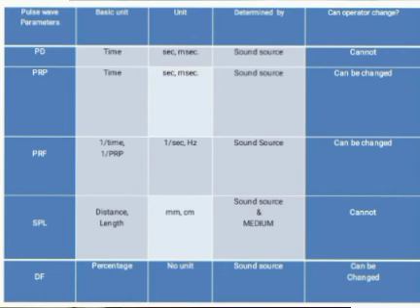Duty factor is inversely proportional to PRP. Duty factor is directly proportional to PRF. Duty factor is important in relation to the study of intensity. So you look at this table of pulse wave parameters and what can be changed. These things I've said before. Just take a look at them and you appreciate what I've said.